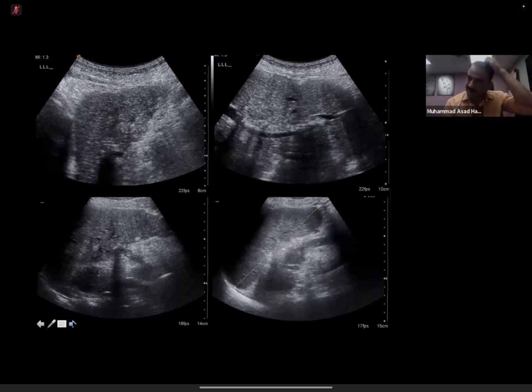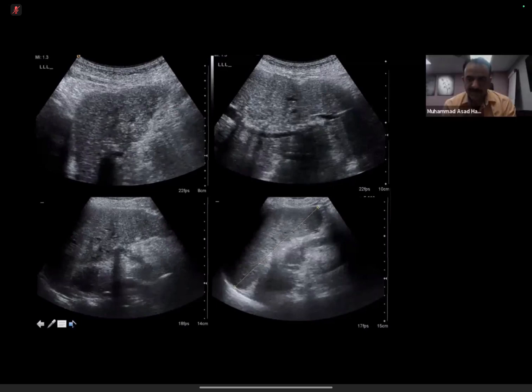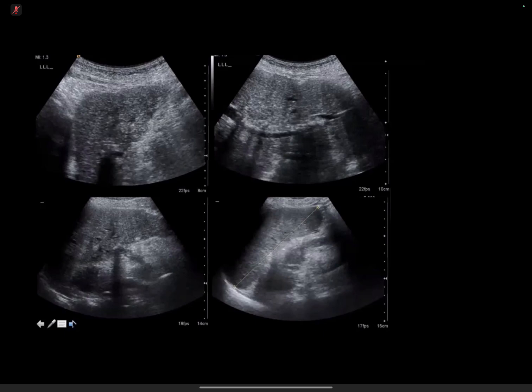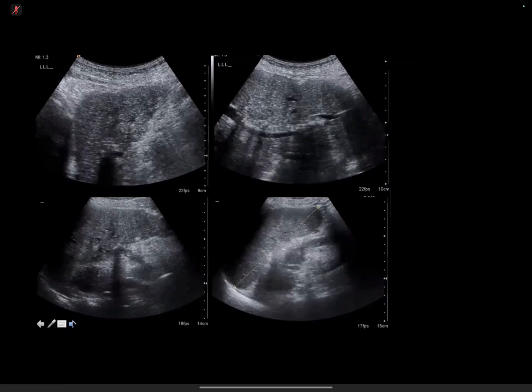Now, describe the transjugular biopsy. How is it done? It's done through the internal jugular vein, and then the catheter is passed through to the IVC. Good. And then through the IVC, the liver tissue is obtained by the transvenous route. Why do we have to do the transjugular biopsy? What are the benefits? With a percutaneous biopsy, you have to breach the liver capsule. With a high INR, that potentially increases the risk of bleeding, and clotting will be difficult to achieve afterwards.